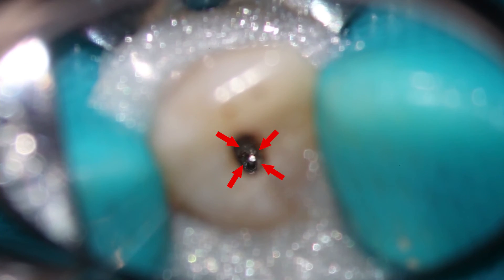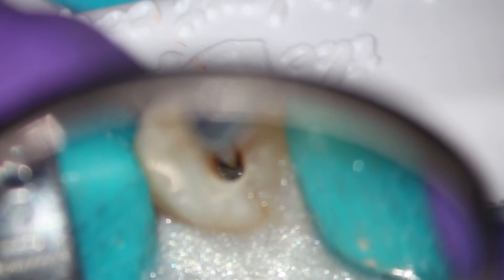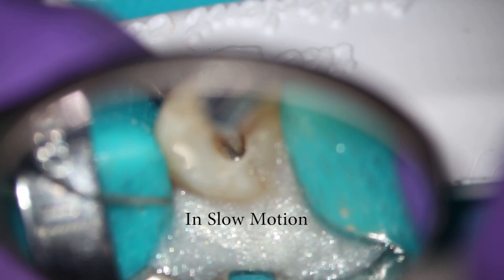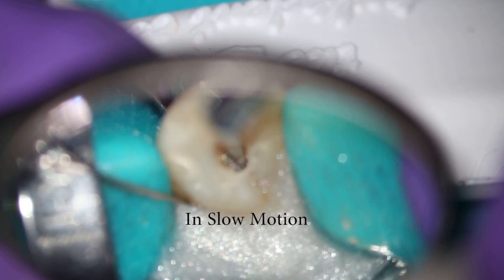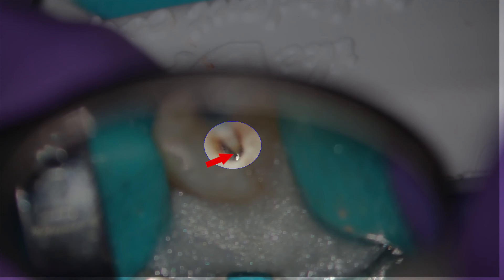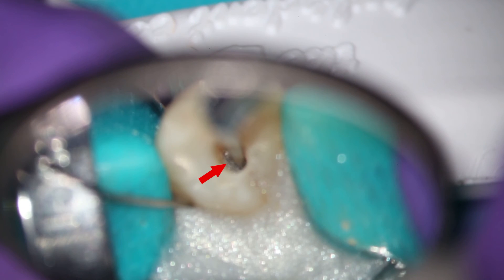Now all we really need to do is place the side of the SP2 alongside the instrument and it will vibrate up. In slow motion, you can see how it works. This is usually done with water — you don't want to heat up the instrument. You use the side of the instrument and most of the time the instrument will vibrate right up.